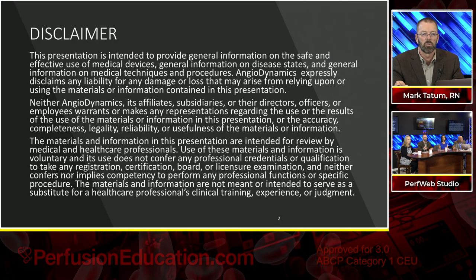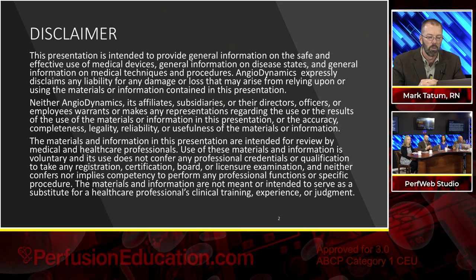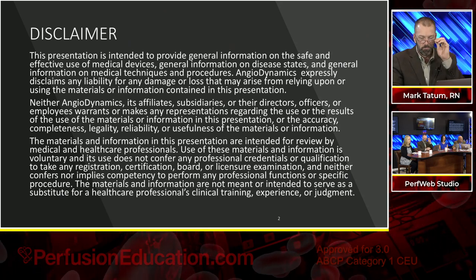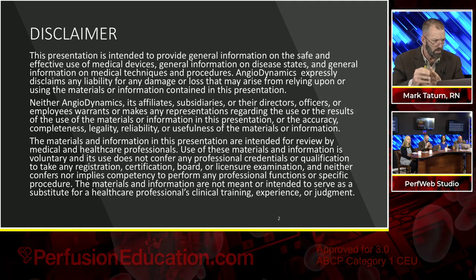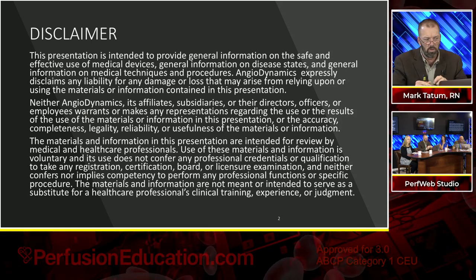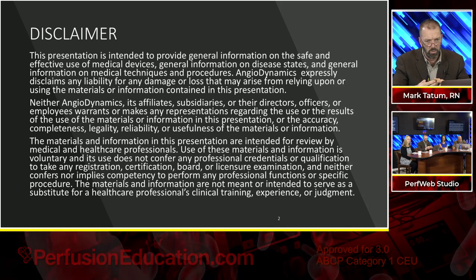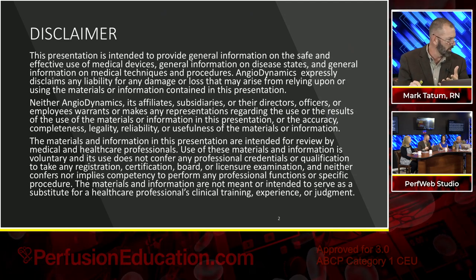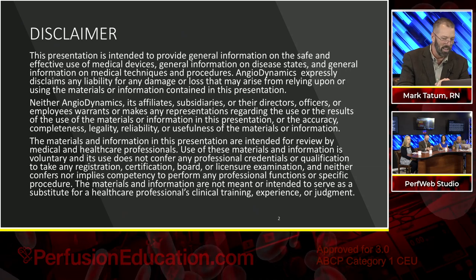I'm going to go ahead and click through a couple of these slides. There is a disclaimer here, and I only bring this up because I'm required to by law. The other reason I bring it up is that in our indication, when we get to this, there's a space that talks about the fact that we are contraindicated for use with severe venous or arterial vascular disease, which seems a bit counterintuitive. But as most of the audience will understand, we're predicated on a venous drainage cannula. Clearly, you wouldn't normally put a venous drainage cannula in a place that has a significant amount of blockage.